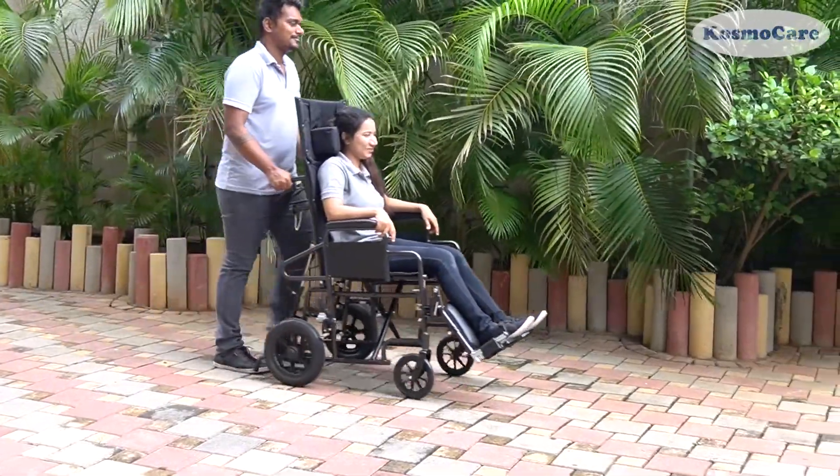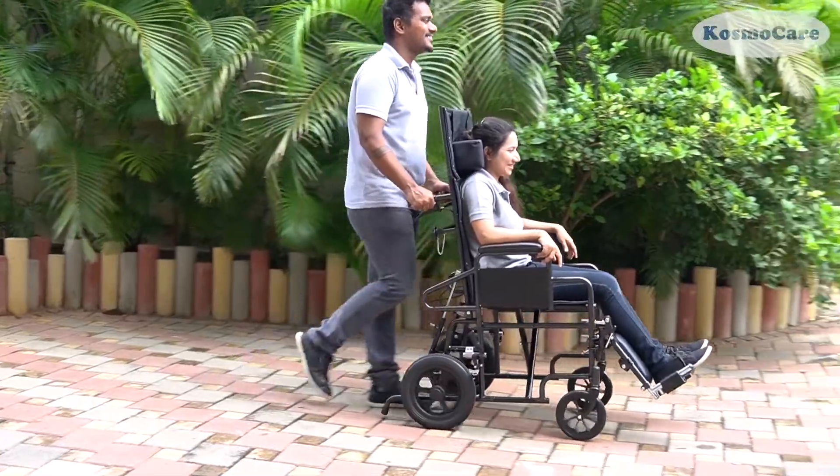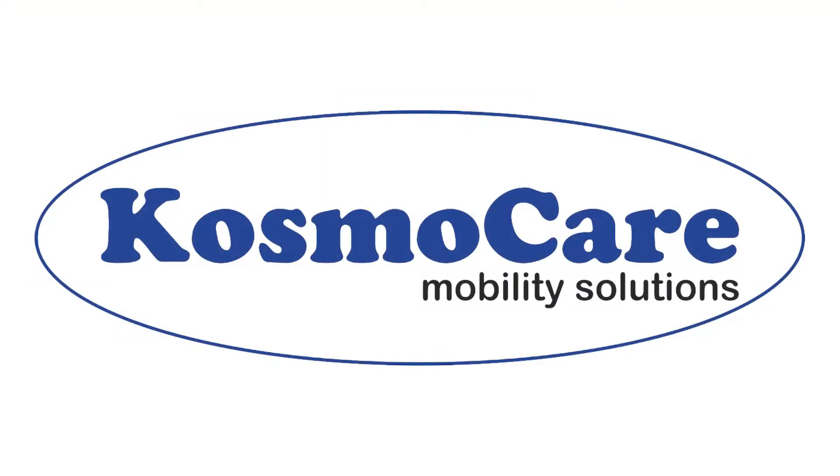Give your loved ones the convenience and freedom they deserve with the Tranz Recliner wheelchair from KosmoCare.